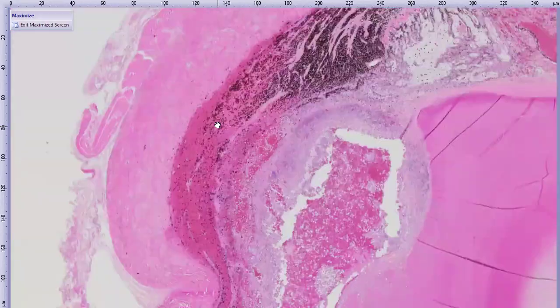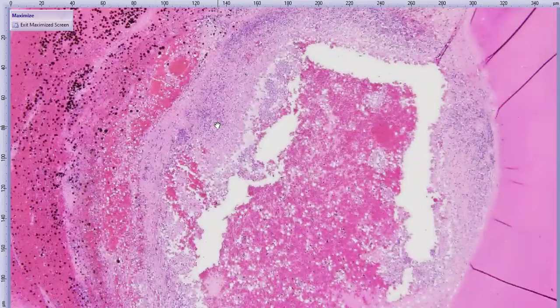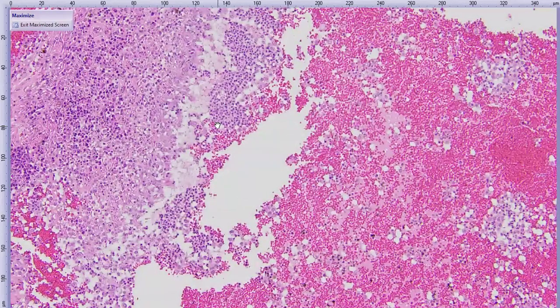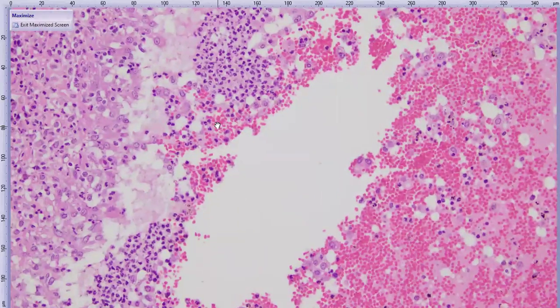And if I was smart, I would have put a dot on this slide, but I wasn't. So, paralysis of the marking pen hand, as Howard Steinberg would say. But I'm pretty sure the thing I'm trying to show you is here. And if I spend some time looking for it and don't find it, we'll move on.